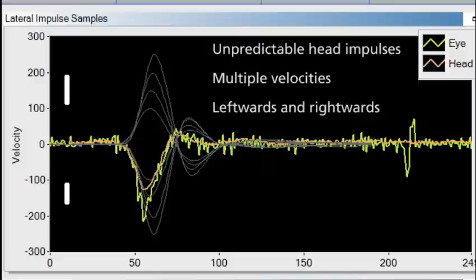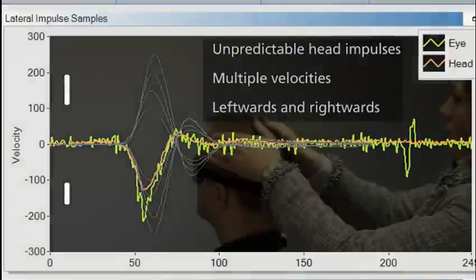You want to make sure the patient cannot predict which direction and at what velocity the head impulse will be performed.